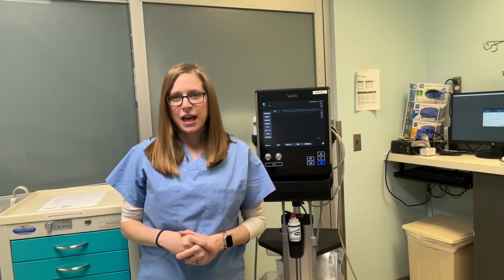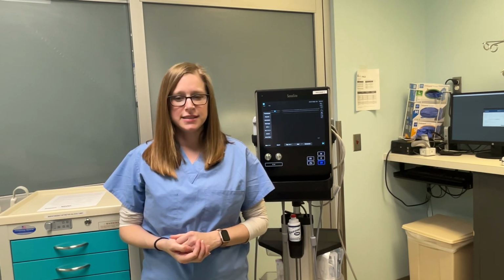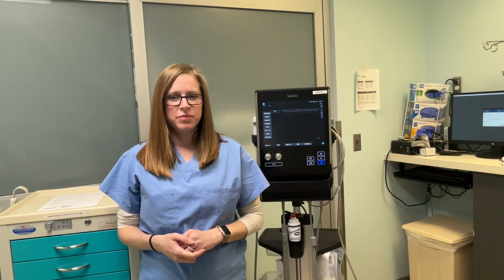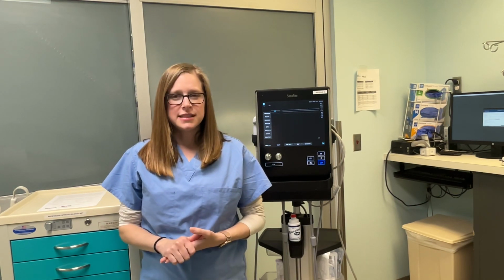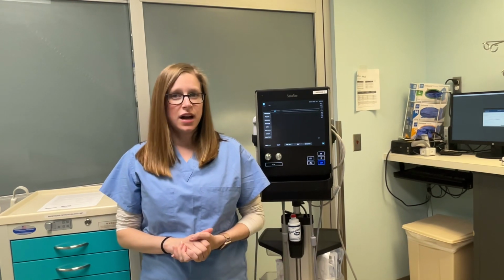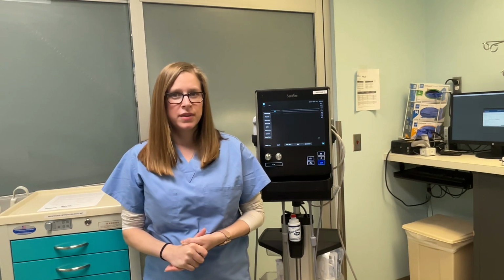You want to then check Epic for 2 orders. The first being ropivacaine, and you can release that order. The second is for ultrasound guidance by anesthesia. This order is very important because that is how you can bring up the patient information on the ultrasound. If it is not there, the nurse can place the order per our protocol.